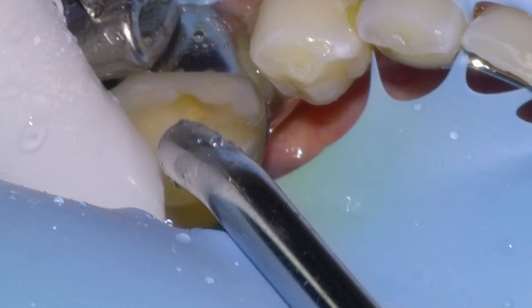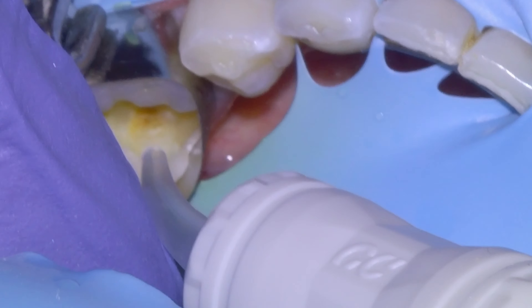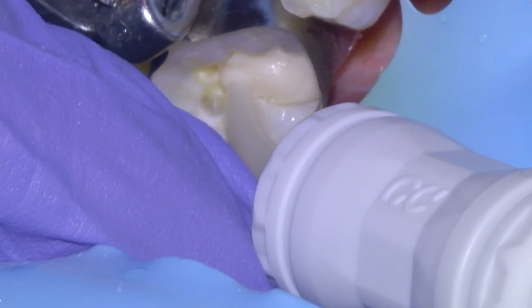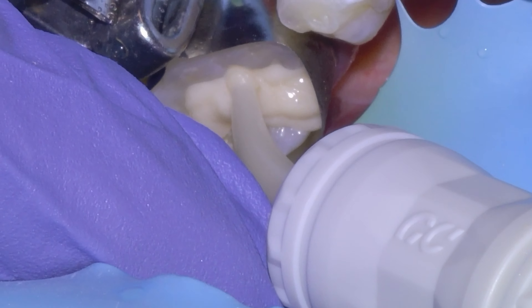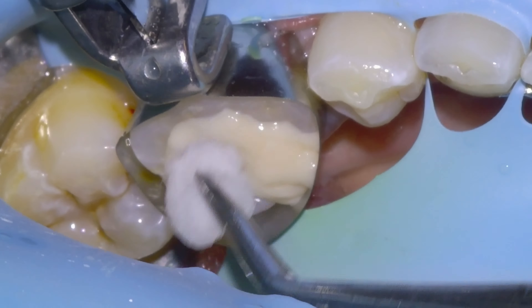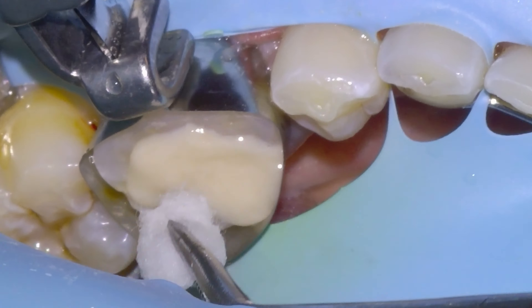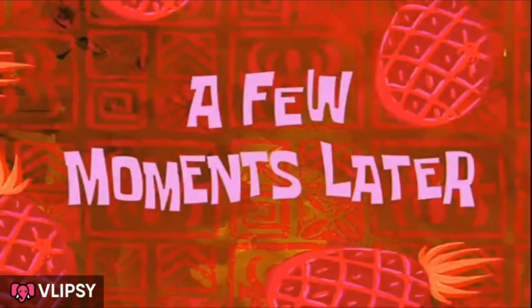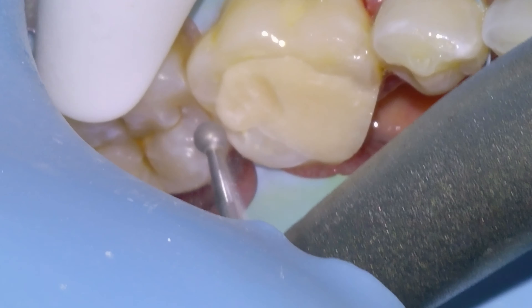Rinse it off thoroughly, dry the tooth, and then Jackie's going to mix up the Equia Forte. It goes right from the mixer into the tooth and we're going to fill it up — typically overfill the cavity — and then pack the excess material in with a moist cotton pellet to make sure it's well adapted to the surface of the tooth and the margins.